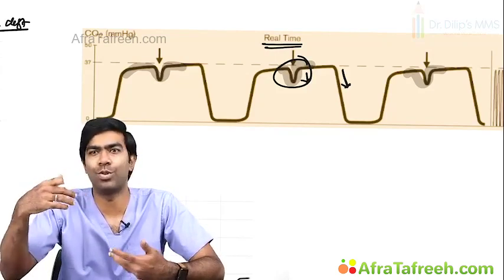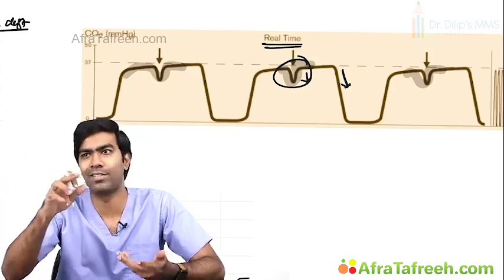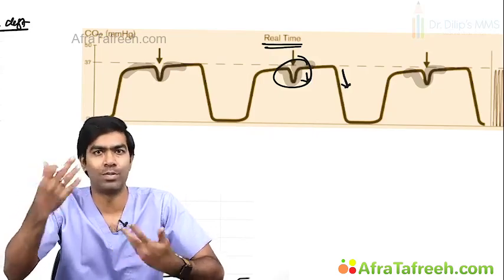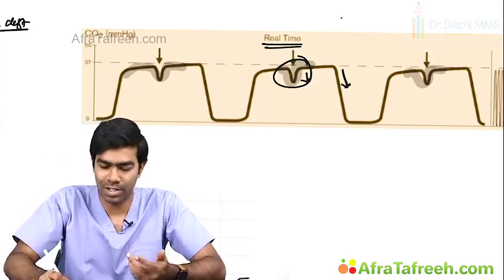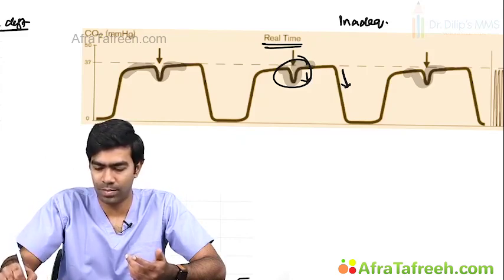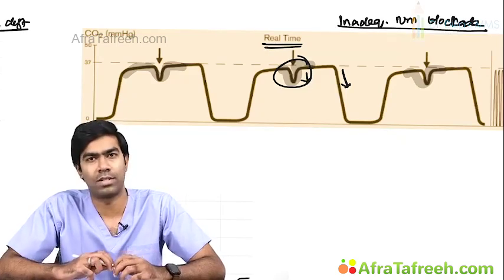That's why a patient who should respect the ventilator is not respecting the ventilator. When the ventilator curve is going towards expiration and exhalation, the patient is taking some spontaneous breathing efforts, which clearly shows the patient has an inadequate neuromuscular blockade. Here the idea will be to increase the level of blockade and give a better paralysis to the patient. So this should not happen.